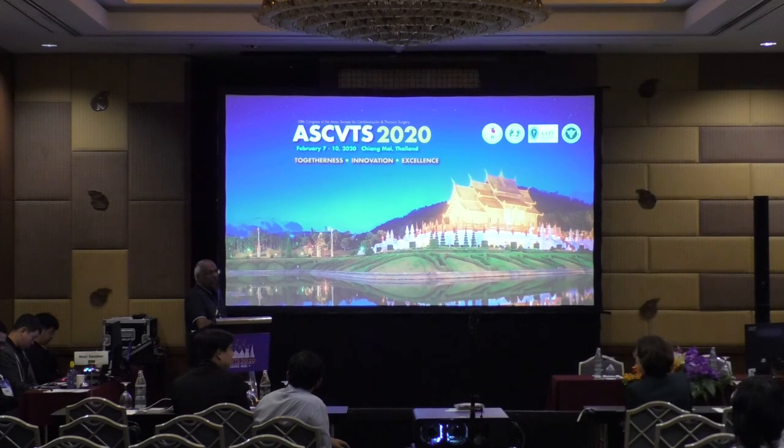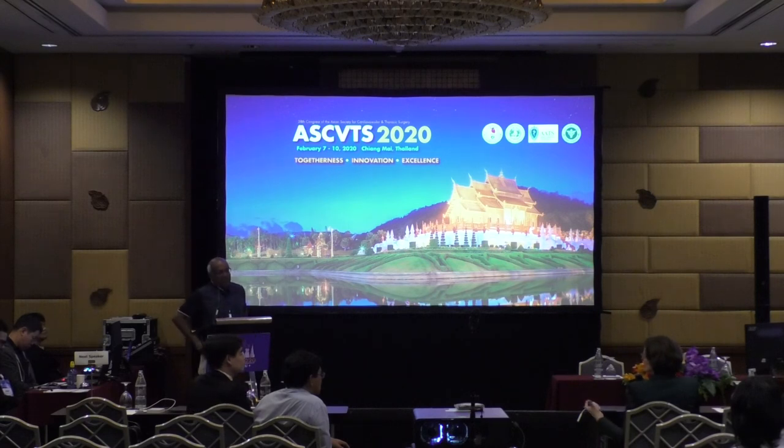In other words, I don't think auto strain is just a good way of getting it more conveniently, because people still move those lines, and the number is different. I think the big issue is if you're going to do things like alter chemotherapy in a patient with breast cancer based on a decline in strain, you do want to be very confident it's real. That is my biggest concern. Even in our own center, we have been so critical about our data.